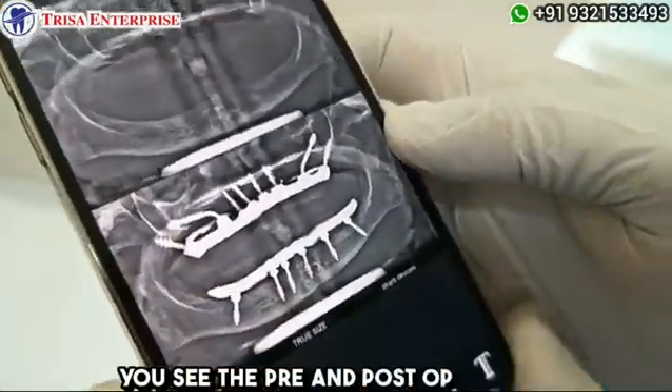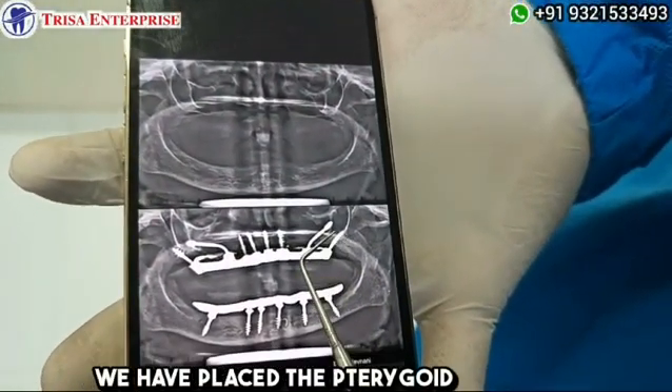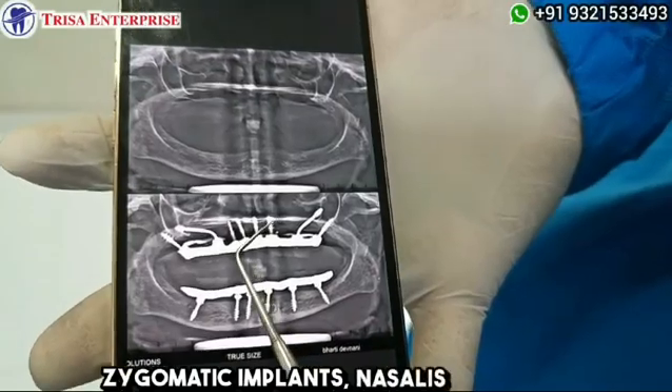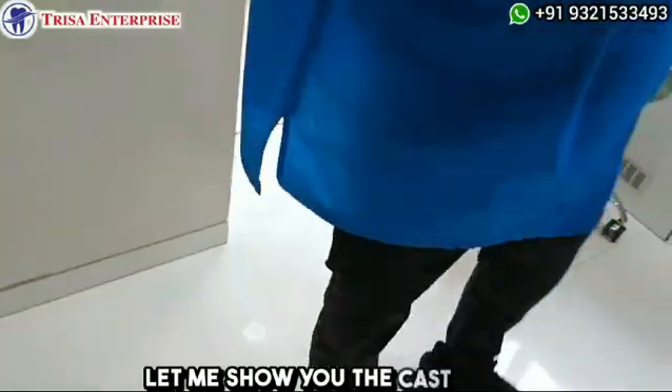You can see the pre- and post-op images. We have placed pterygoid implants, zygomatic implants, nasalis implants, and in the lower arch everything is a screw-retained retrievable prosthesis. Let me show you the cast as well.